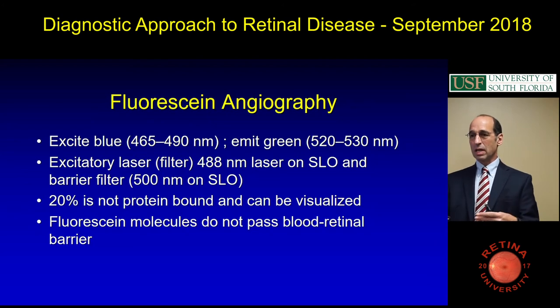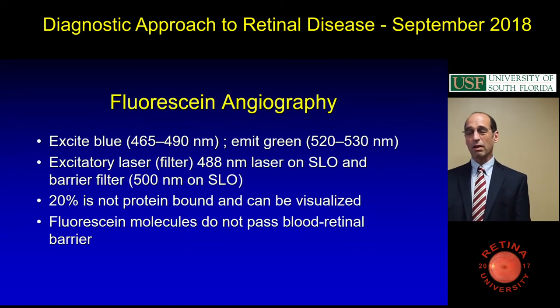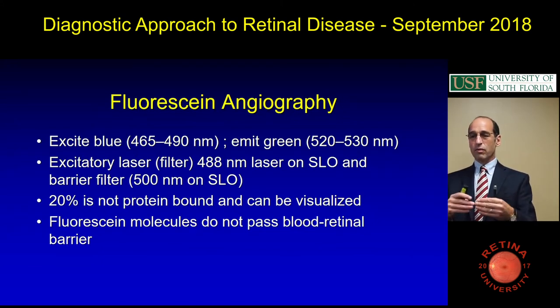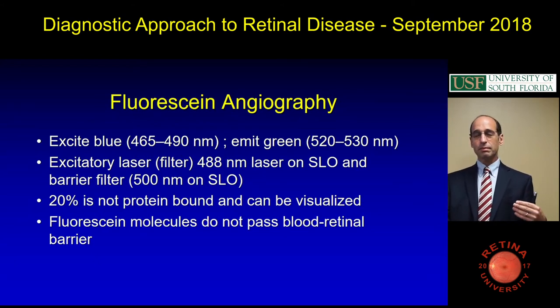And it's a good gauge because fluorescein doesn't pass an intact blood retinal barrier. So that's why the blood retinal barriers are super. If you're doing a fluorescein conference, you're pretty much looking the entire time at the blood retinal barrier. And so you need to know where it is. So the blood retinal barrier is the RPE and the endothelial cell tight junctions of both of those. And the fluorescein won't pass that if it's intact, but if there's a problem with it, it'll leak.